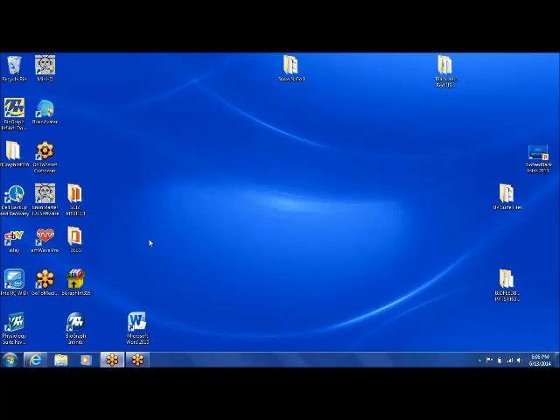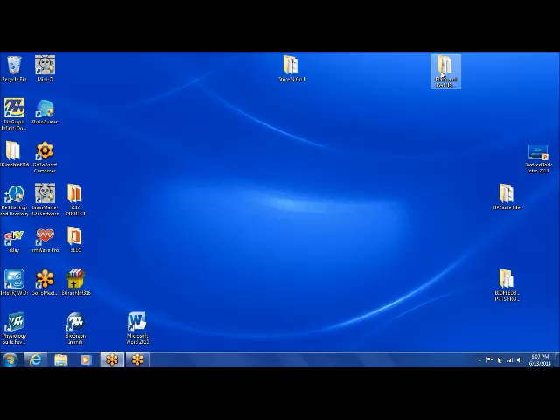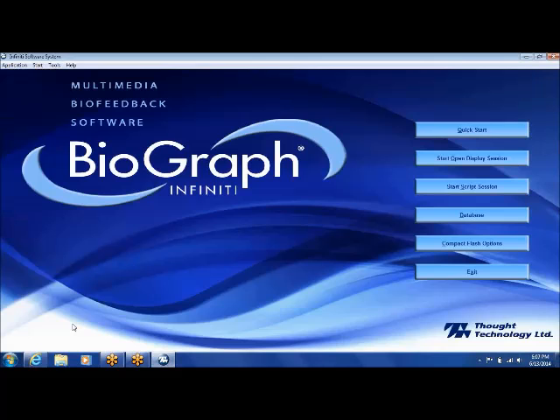I'm going to do a quick demo of some of the Biograph software features. To start the program, we first double-click on the Biograph Infinity icon, and that will open the program up. So we get this screen here.